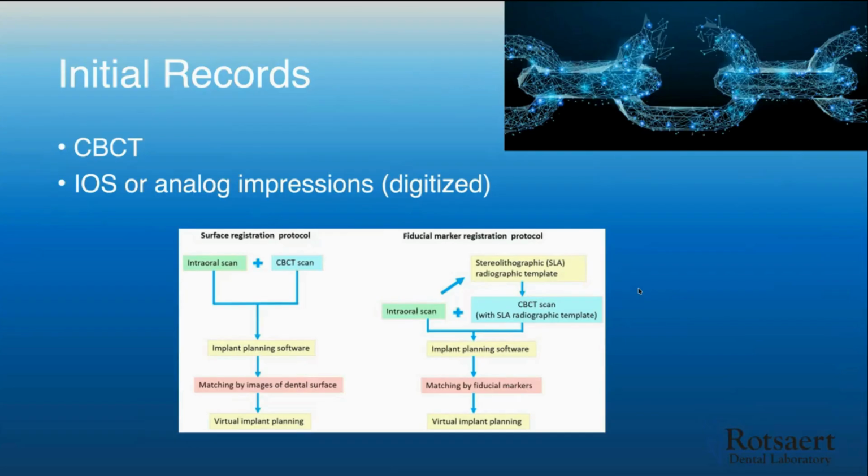Okay, so let's get back to the digital side. So the 2 things that we really need for the implant planning service, well, really one, I can make a start with that and our team here, but the cone beam CT is the minimal data that we need to start with. And by that, I mean the multi-slice data, the files that are acquired through that cone beam CT process, or regular CT, but primarily cone beam CT in our world. And we can then import that into Exoplan and be able to create an implant plan and share that with you immediately.